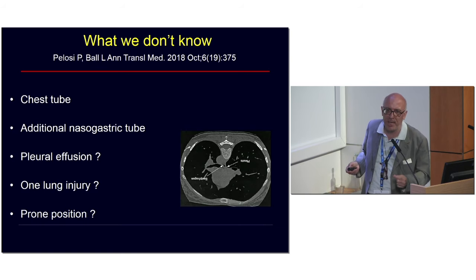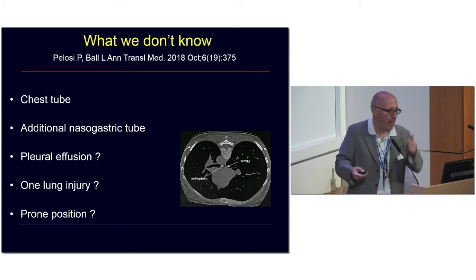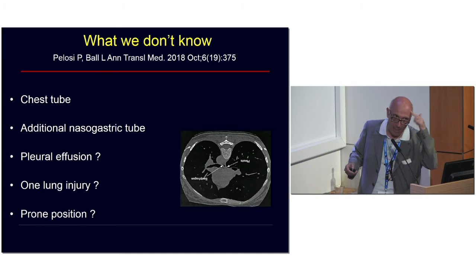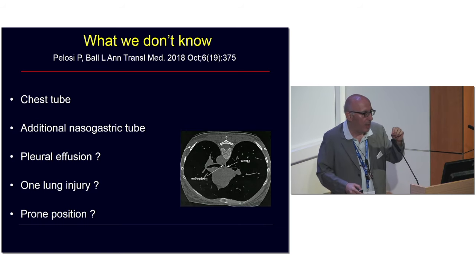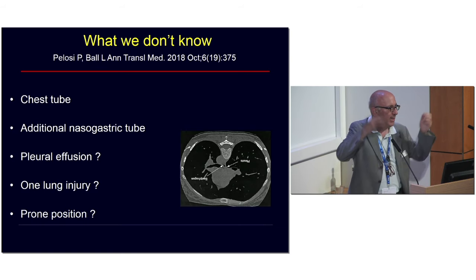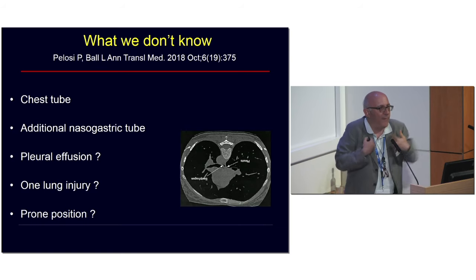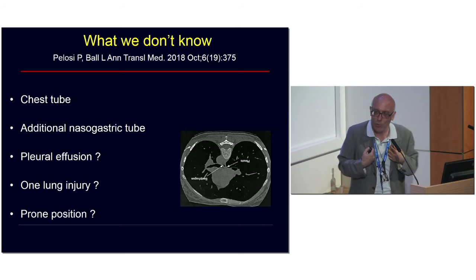We found that those patients who decreased the chest wall compliance have better oxygenation in prone. And we said, wow, yes, because there were changes in regional compliance. Probably it was not like that, but I thought this a year after. Because when you are in supine position, you have the effect of the mediastinum. When you are prone, you have less effect of the mediastinum. So those patients that likely recruited are more ventilated, so they have more change in pleural pressure. And so we found what looked like a reduction in chest wall compliance. But probably it was not a reduction in chest wall compliance. My study should be reinterpreted.